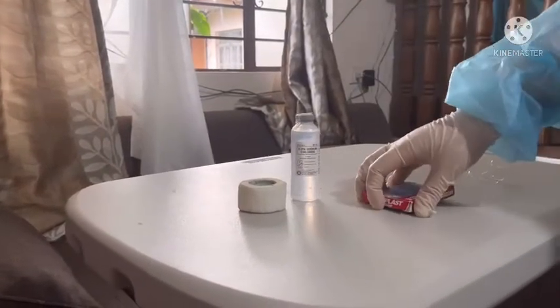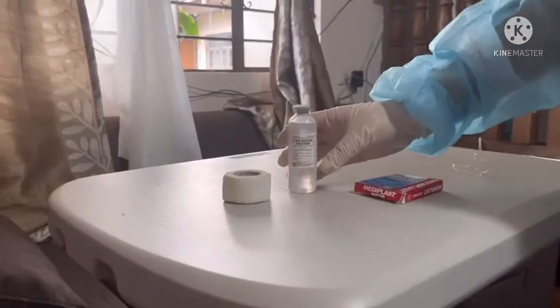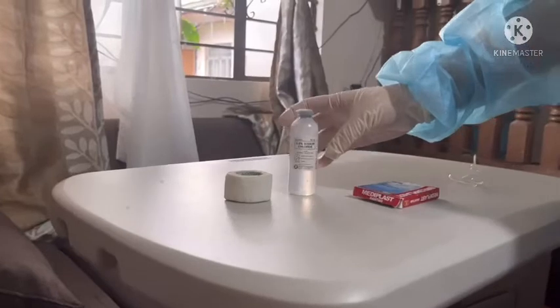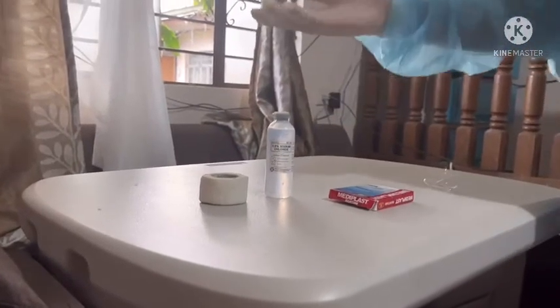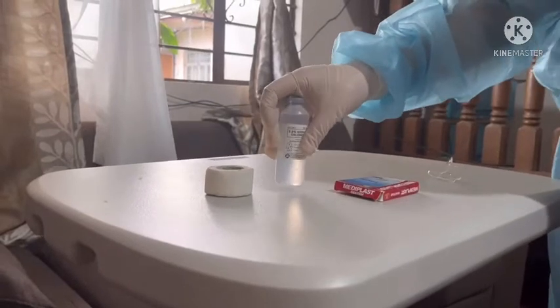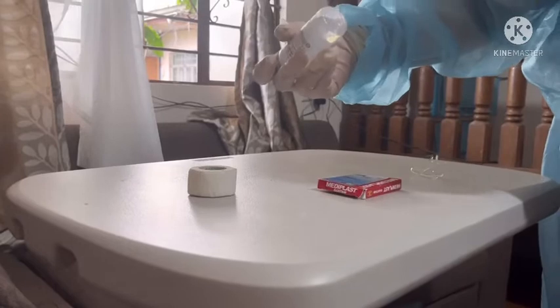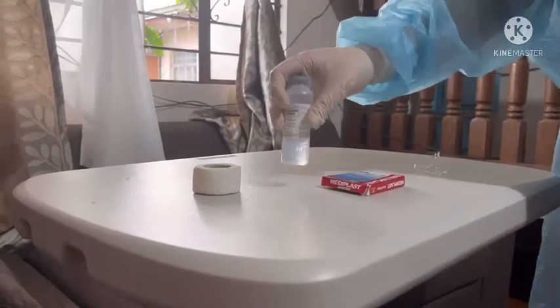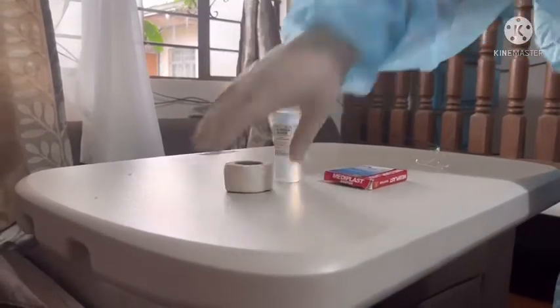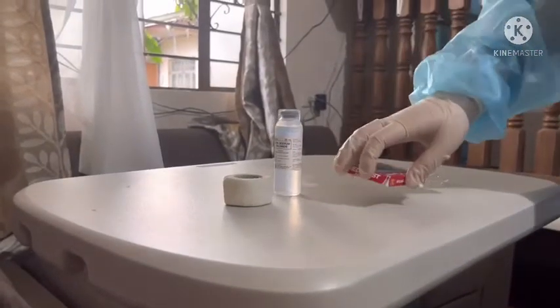The normal saline, you will use when the tube detaches and you want to submerge it in the saline so that it can be sterile again and as clean as possible. The gauze, you can use when the chest tube gets dislodged.